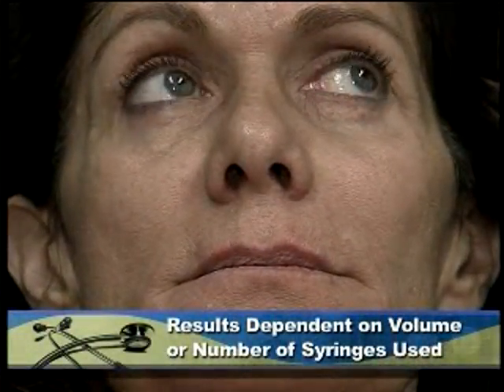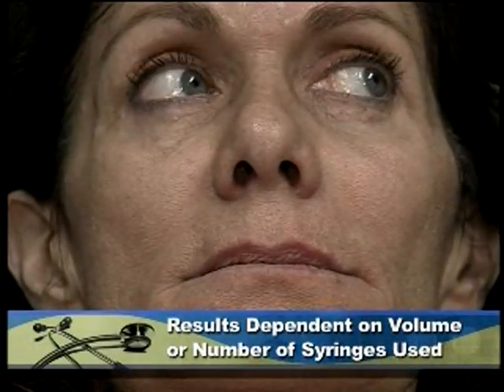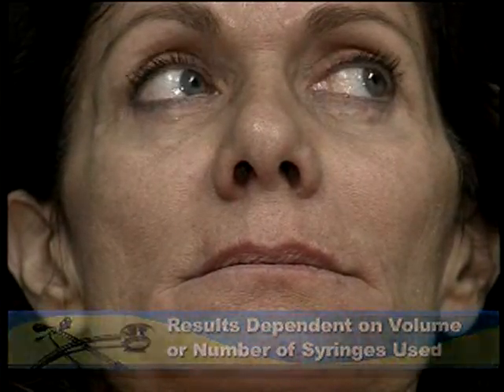When you're doing a threading technique, you don't require as much product as you do with a fanning technique. And that brings up another important point, and that is to make sure that your patient recognizes how much it's going to take in order to get a good result. That needs to be discussed in the preoperative consultation. Oftentimes it takes more than 1 vial of the product, and in fact I would say on average it takes 2 vials to get a nice treatment to both nasolabial folds, at least a vial of product, which is about 1 cc, in order to get a good result.